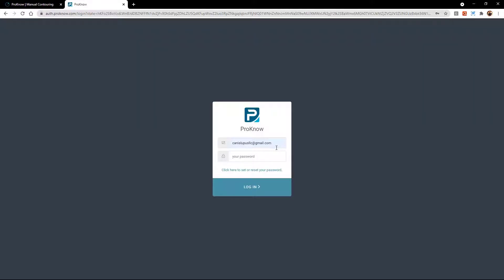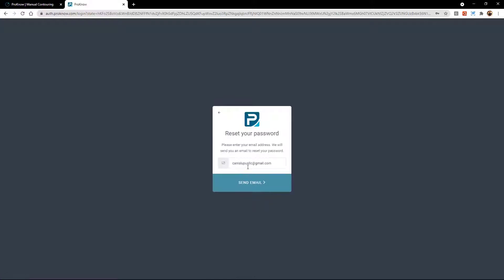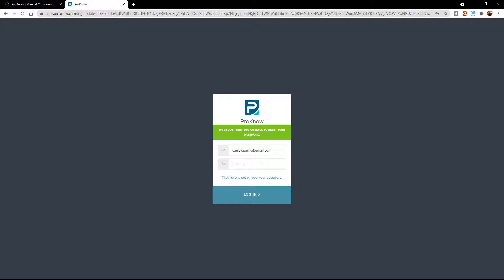Once you have been set up as a user, which the C3RO team managers will do for you, when you type in that URL, you will be prompted to enter your username — which is going to be the email that you registered with — and then your password. Since you don't have a password yet, you click the button that says 'click here to set or reset your password.' Once you do that, you go to your email inbox and should immediately receive an email from ProKnow with a button that says verify who you are and enter your default password. At any time after you log in, you can change and update that password. You just click here, it tells you an email will be sent, you click send email, check your inbox, and once you do that verification, you should be able to sign in with that password.